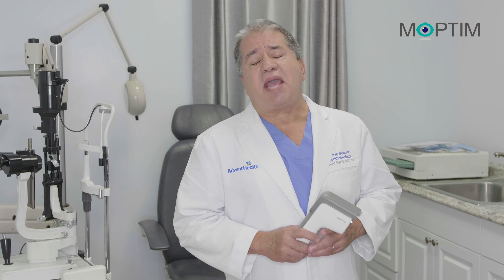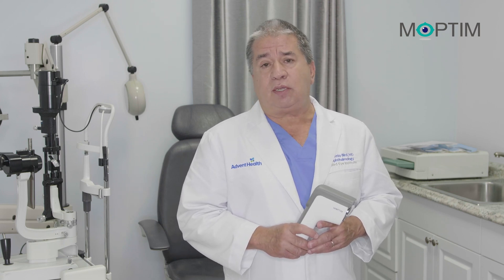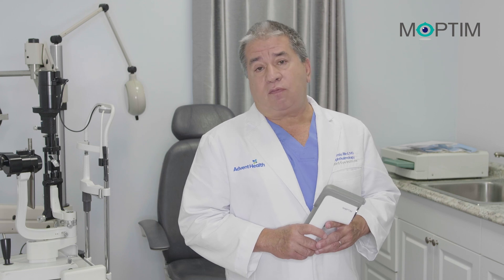The EZ-Ref is an excellent tool in order to improve the care we provide to our patients. Thank you very much.